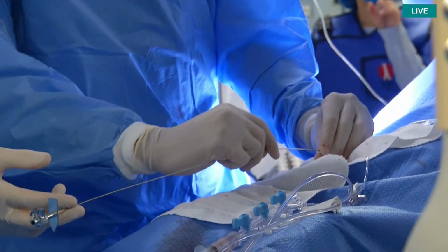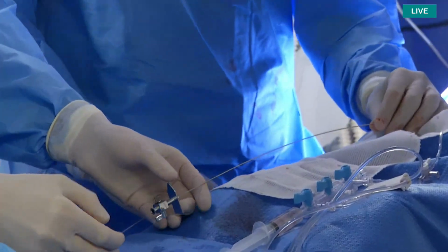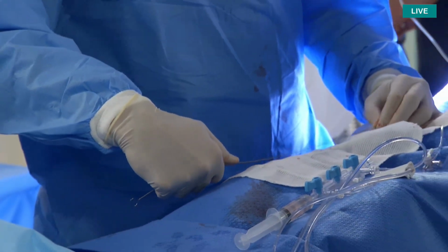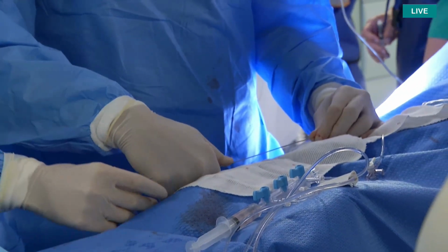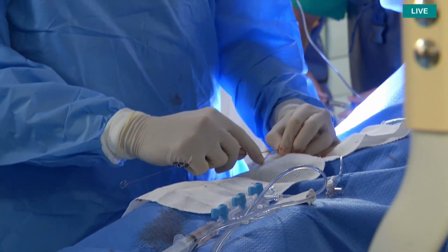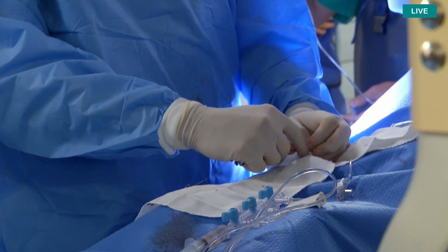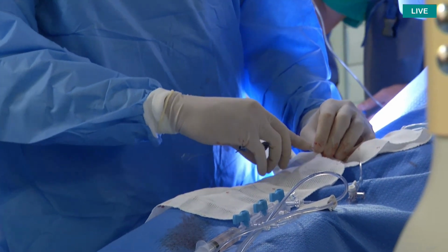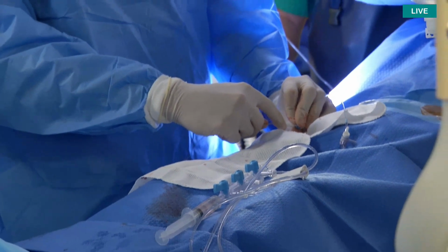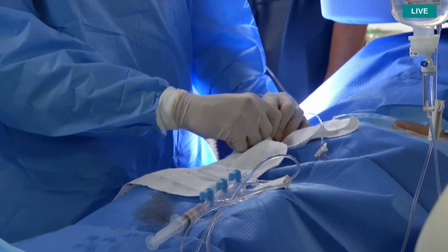Yeah, so this is the classical SL0 and BRK needle. This is not the VersaCross system yet, but this is the classical setup. And be careful, the stylet is still in, but we pulled it a little bit back. Yeah. All right, good. Maybe you can also see fluoro, if you can stream fluoro as well, so then people can follow where the transeptal sheath and the transeptal needle are. So if we can show now, maybe, please stream both fluoro and echo.